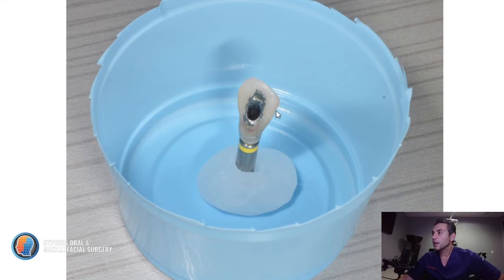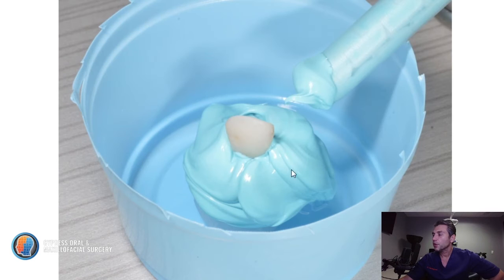So we take this impression coping and the temporary tooth complex, as I call it, and we put it in a little bit of wax in a paper or plastic cup. And then we actually take an impression of the bottom of the temporary. You want to make sure you fill this up all the way.